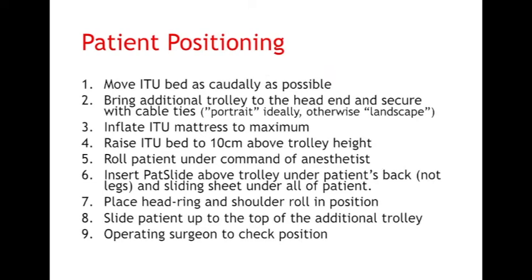As outlined in the last slide, the position of the patient should be discussed in great detail prior to putting on PPE and entering the patient environment. This protocol has been set up to facilitate the delivery of surgical tracheostomy at the bedside. To achieve this, we recommend that the ITU bed is moved as far down the room as possible with maximum space at the head end.